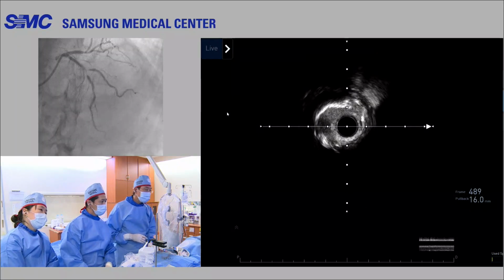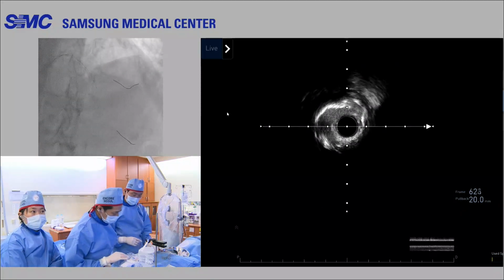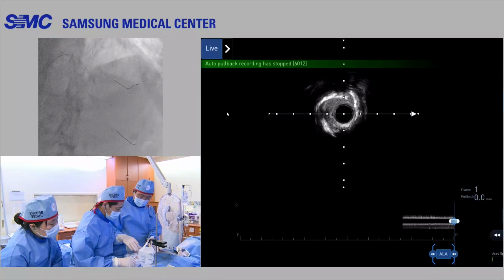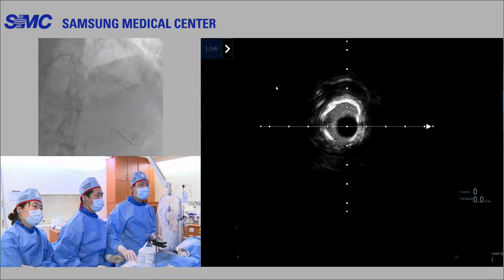Not a treated segment. It's very slow. Again. Sorry, we didn't get it. Again. Pull back again.